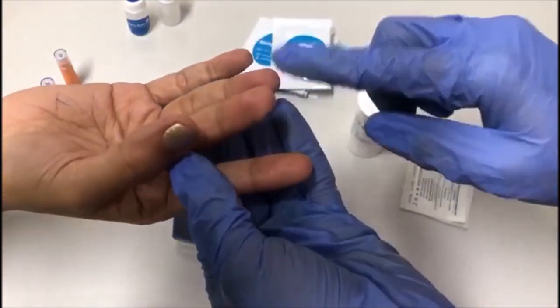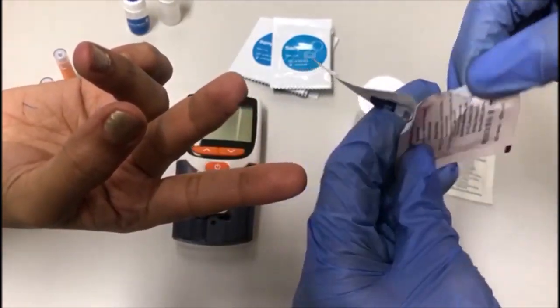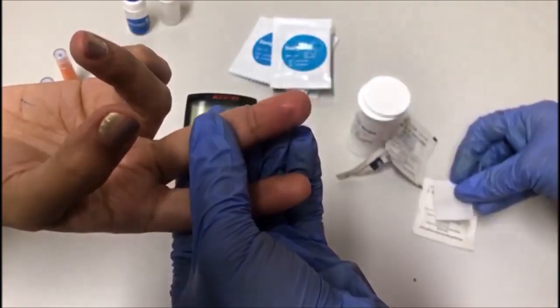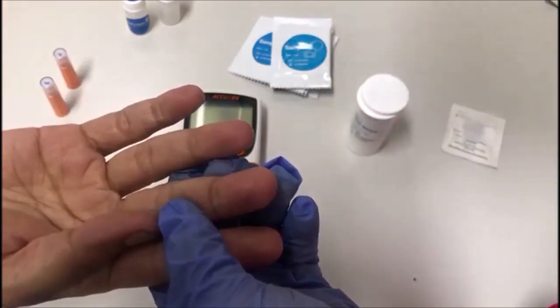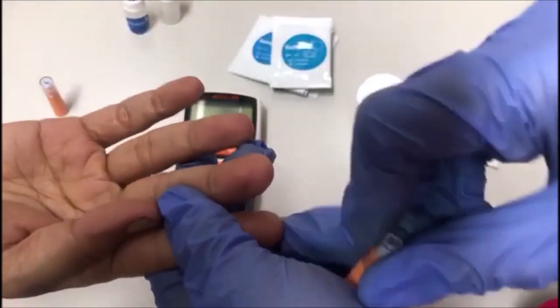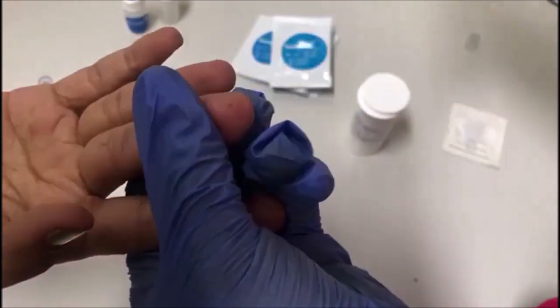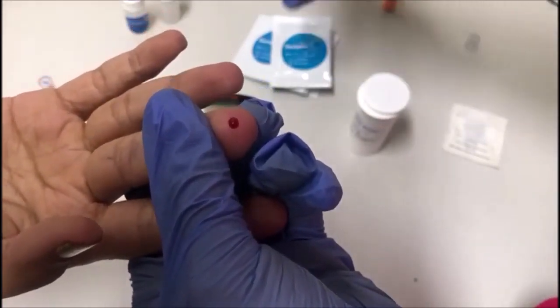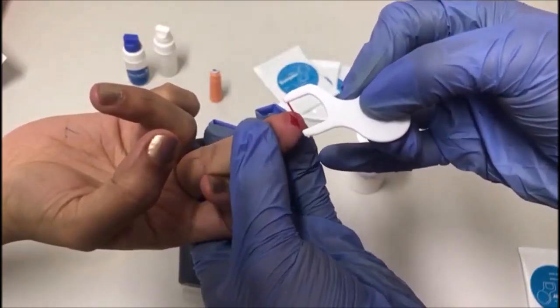Select the middle or ring finger. Disinfect the finger with an alcohol swab and let it dry completely. Prick the finger towards the side. Open the sampler and saturate it with blood. Do not remove the sampler until it is completely saturated with blood.